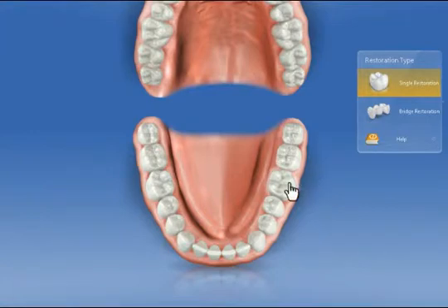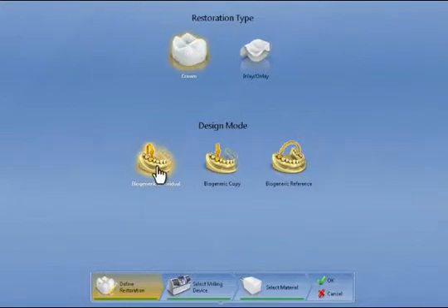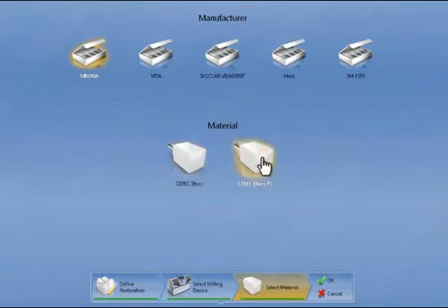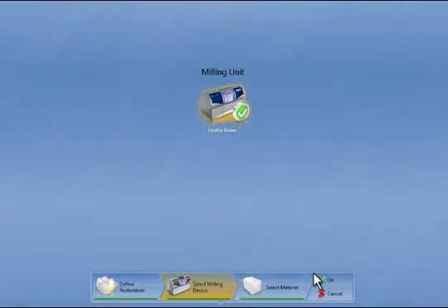New in version 4.0 is that we can now do multiple restorations. We have prepared tooth 3.6 for a full crown and select biogeneric mode for individual calculation. We can also select a specific material — in this case, a CEREC Blocs PC. Now we can choose the machine on which it can be subsequently milled. Here we have selected an MCXL unit.